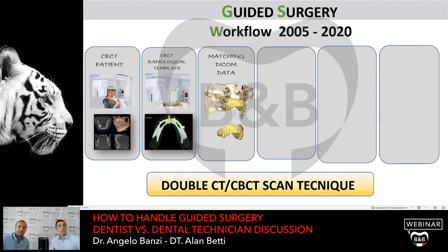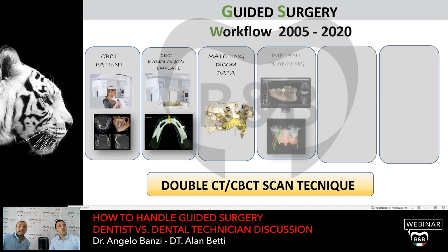These two DICOM data have to be matched together, and actually the technician is going to do this matching. And as you can see from this imaging, once the matching has been done, it can be read by the surgical software.